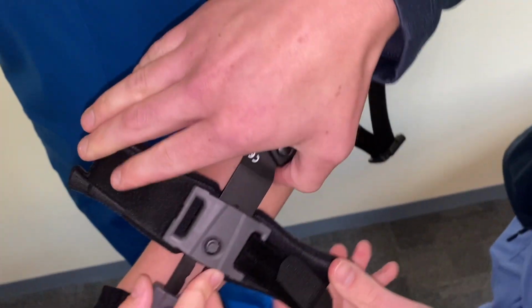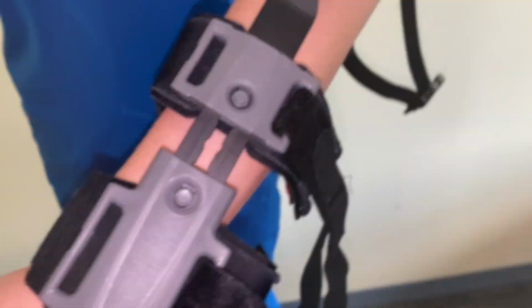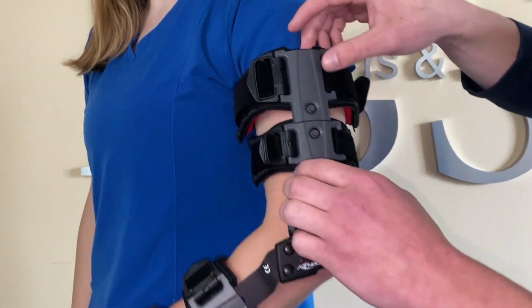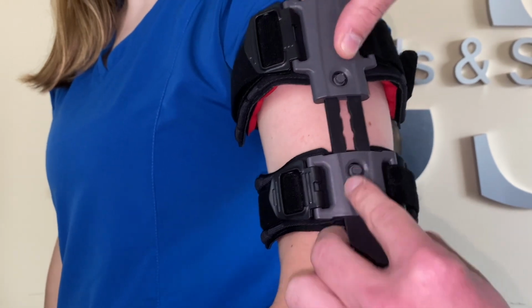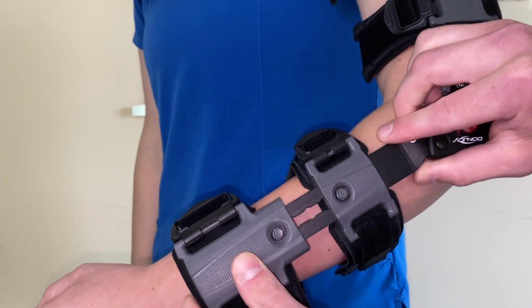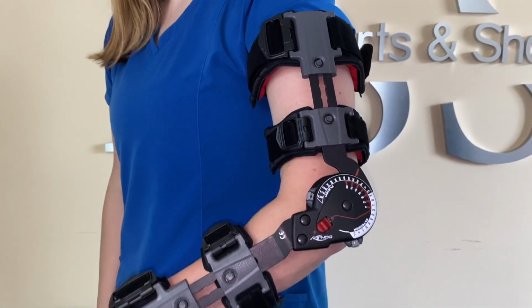The top cuff will be just below your axilla or armpit, and the bottom cuff will be just above your wrist. On each cuff of the brace, you will notice a button. This button allows you to modify the length of the brace. Once we customize it to you correctly, you should not need to adjust the length, and instead will simply need to apply and remove the brace.